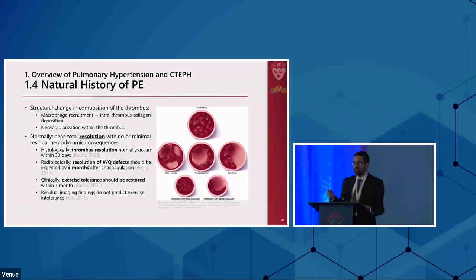that when he used to go to conferences, he used to show a scan and say, is this acute or chronic PE? And then people would say, oh, it's acute. And then he would show a scan from 3 months ago and show it was the same thing. So no, it's chronic PE. The point was that you can't really tell if it's acute or chronic PE from the scan, because you need an interim scan.